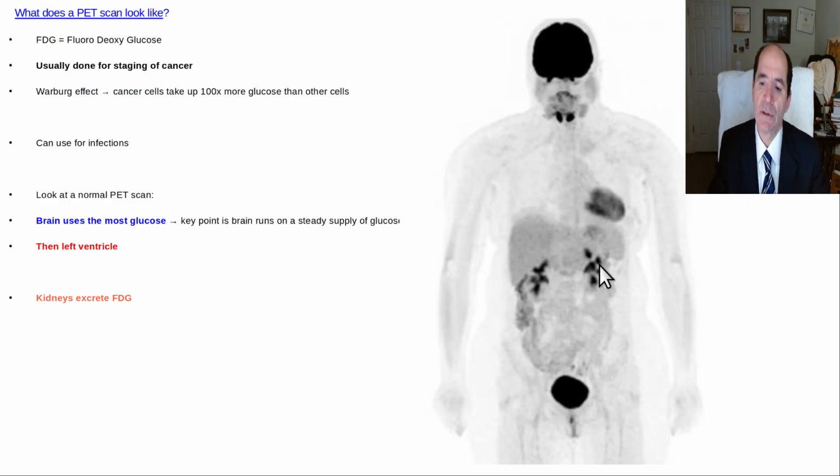And there are some mesangial cells that burn primarily glucose, but the purpose of this was to see that the number one glucose user is your brain. And so if you mess with glucose metabolism, diabetes is the gateway disease to all the Western diseases, diabetes and hypertension. Very high risk. You're going to end up stupid at a young age, late 50s, early 60s. So that's a normal PET scan.